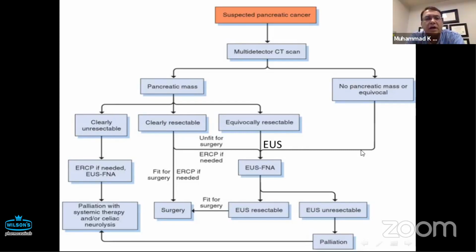This algorithm is basically applicable to adenocarcinoma, where you see a post-obstructive ductal dilation, because that usually does not happen with lymphoma. Some characteristics: with adenocarcinoma it's an irregular border. It's not a very round border, which can happen with a neuroendocrine tumor. There may be a little bit of cystic degeneration of those. A tumor like those is one we need to evaluate further with EUS before going for surgery.